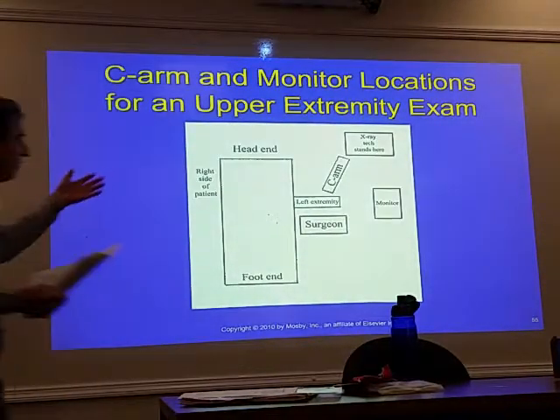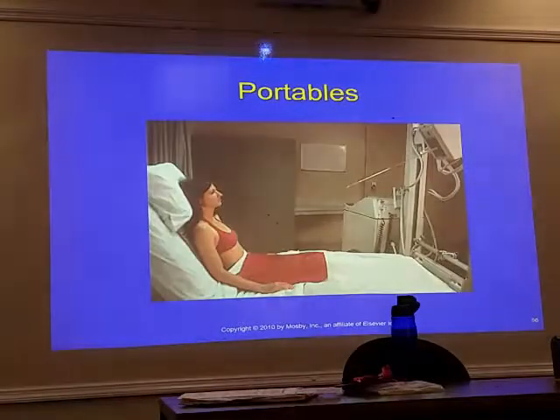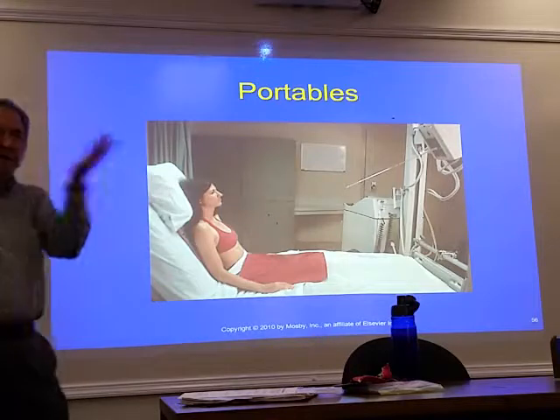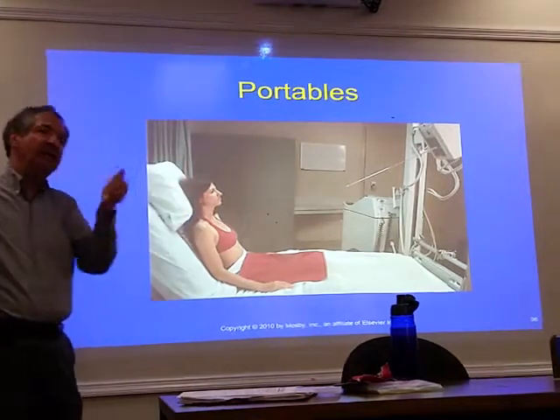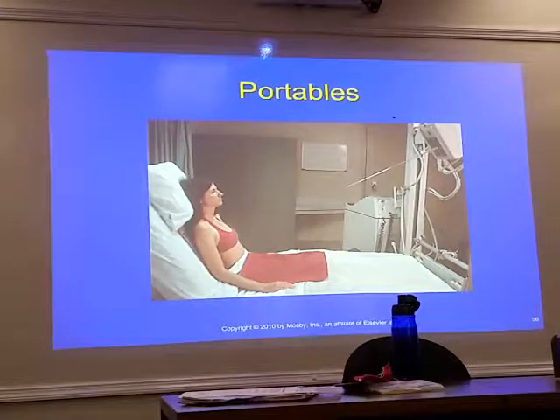If you had an extremity that you're doing with a C-arm, a lot of times they set it up this way. But again, until you reach that, you can just use that as a reference here. With a portable, the patient may be slumped over, you're doing semi-upright, and the cassette is upright like this. You need to angle with the patient, not with the cassette, or you'll get a beautiful lordotic in this case, okay? So just keep that in mind.